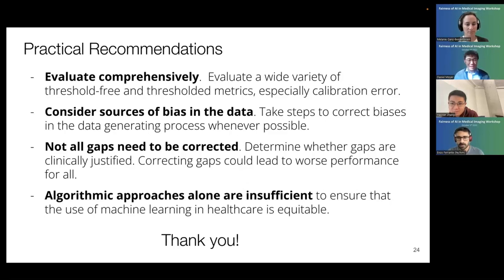I would invite the Zoom audience to put their questions in the chat. But I know that we already have one, so I'll read it out to you. This is a combination question from Mehan Neurojan, and then it was added onto by Ben Glocker. We know that MIMIC-CXR is highly biased and has confounding factors, so there are age differences and sex differences, and those are entangled in the protected demographic. So not only do we want to be fair across age differences, but across ethnicity differences, and those factors are entangled, and those are entangled with disease factors.